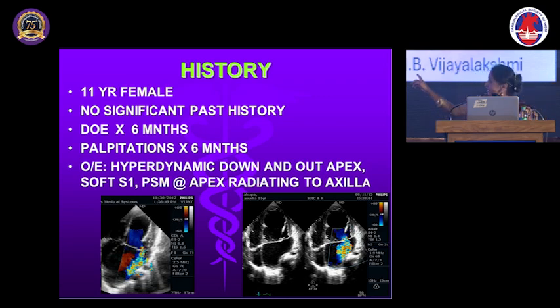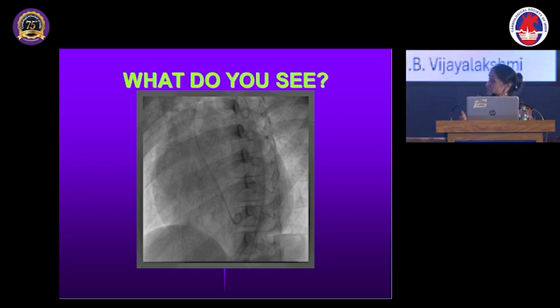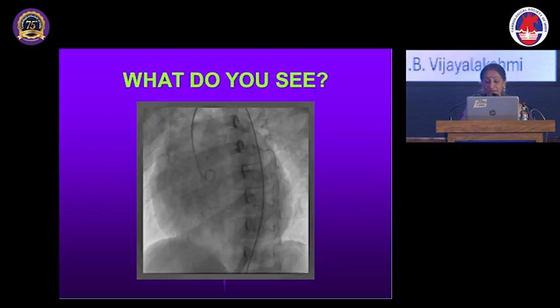So the patient had a mitral stenosis as well as coarctation. I opened the coarctation in the same sitting, and afterwards the mitral stenosis balloon valvuloplasty was done, and the patient is doing fine. This is a 23-day-old baby, and you can see that the ascending aorta is 110 and the descending is 68, pre and post dilatation.